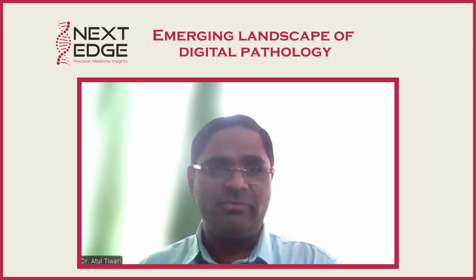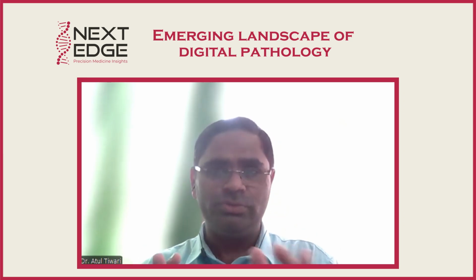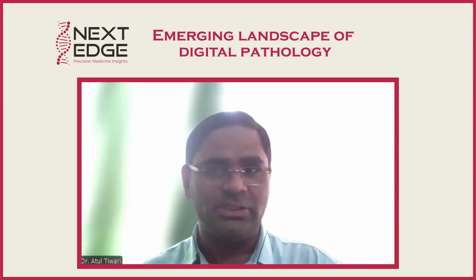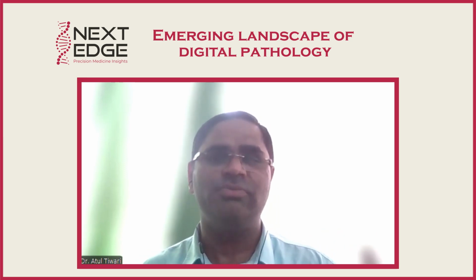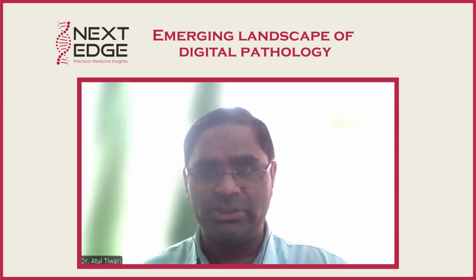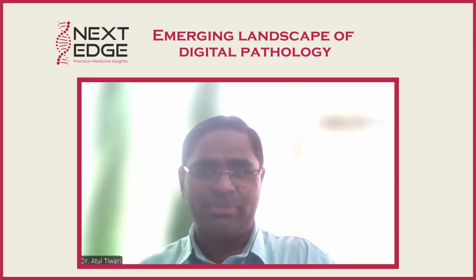What do I mean by visualization? In traditional pathology, we can hardly view the glass slide with more than one person, or if there is a dual-head microscope, then two people can visualize at the same time. Or if we go into the medical college, then they can use a deca-head microscope, where 10 students can learn from one slide. As you are also a pathologist, yeah.